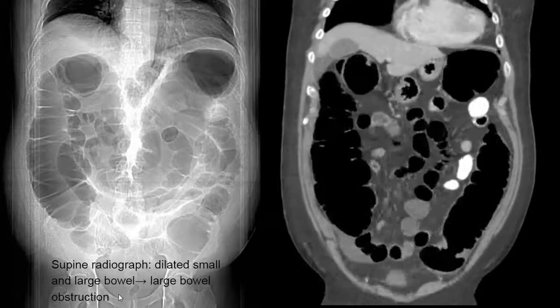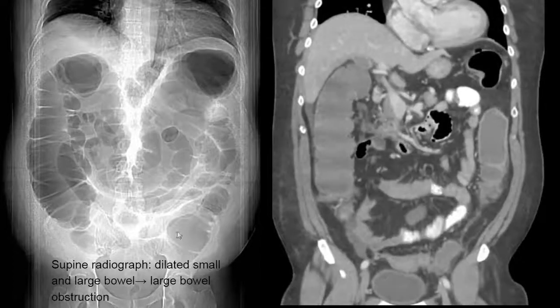Here is another example of an abnormal radiograph. In this case we see both small bowel and large bowel distension. Remember, large bowel is like a picture frame along the boundaries whereas small bowel is more central. Here we see dilatation of both, which suggests that the obstruction is probably closer to the descending colon sigmoid region, which is concerning for a large bowel obstruction.